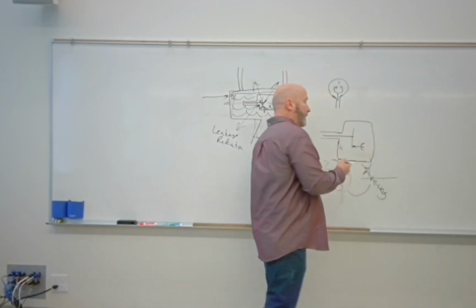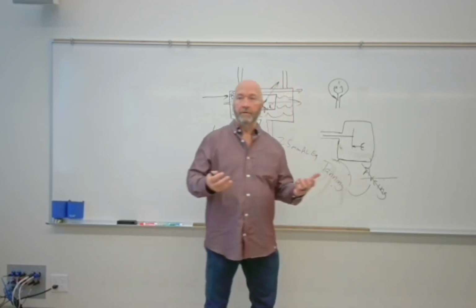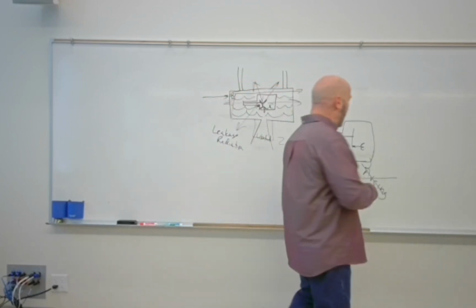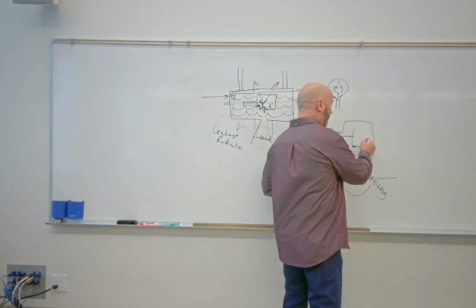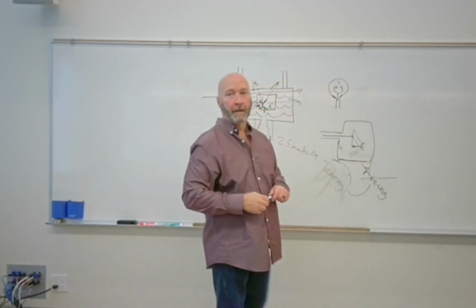So because all of the electrons are negative, all of them the same charge, and we know that like charges repel, then as we apply the KVP, if they're already pushing each other apart, once we hit the KVP, the electrons are going to try to go all over the place, right?